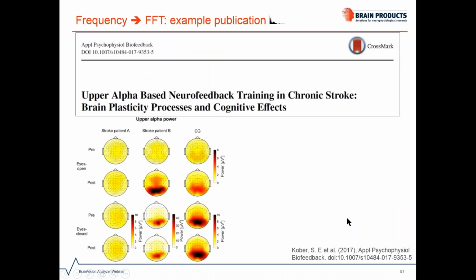Here's another publication showing eyes open and closed conditions in 2 groups of stroke patients and a control group before and after some kind of neurofeedback training. Note the parietal or occipital location of the effect is also shown here as we saw it in Analyzer.